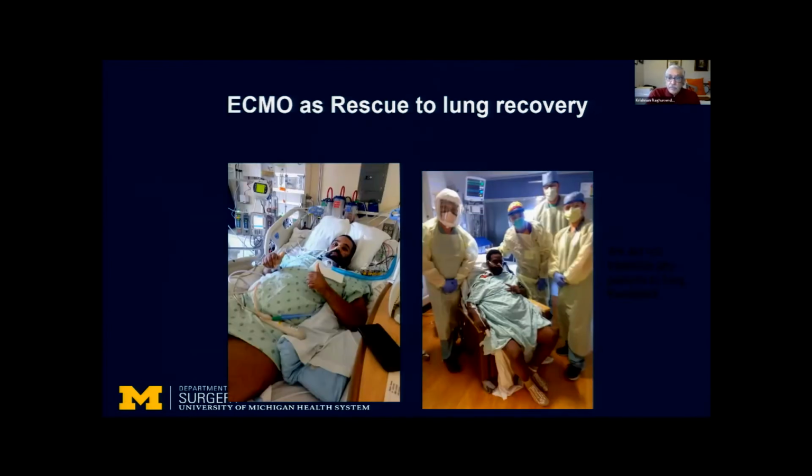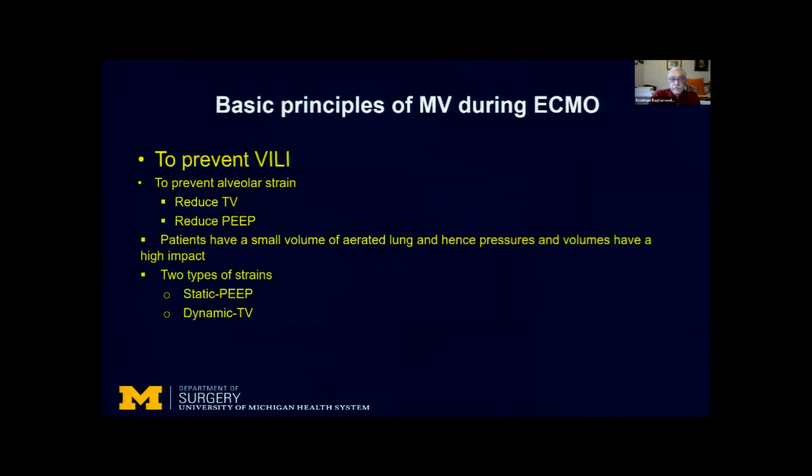So I wanted to once again emphasize, not sure whether you're able to see the little writing on the text box, we did not transition any patient to lung transplant. And our optimal and primary goal was lung recovery. This is a few of our patients that I took care of personally in May and June. And as you can see, they've done well and gone on to recovery and rehabilitation and actually back to active life.